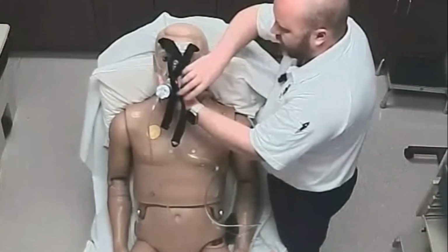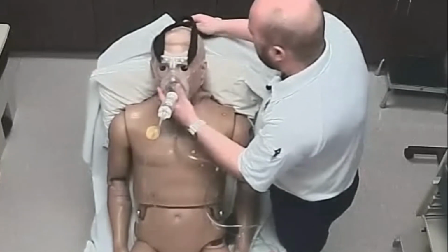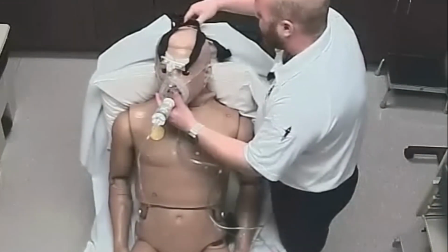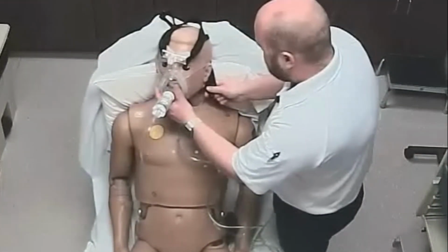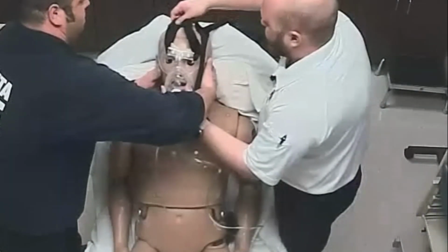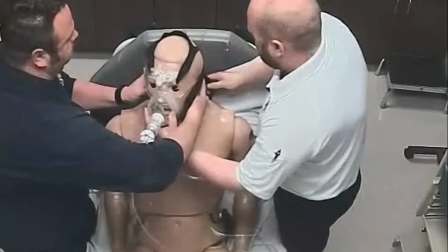Then we're going to tell the patient we're going to apply the head strap. So lift the head strap up and over. When you're doing this skill, you can have a partner help you, because it is kind of difficult to strap this thing around. Make sure you loosen the straps first. There you go. There we are.